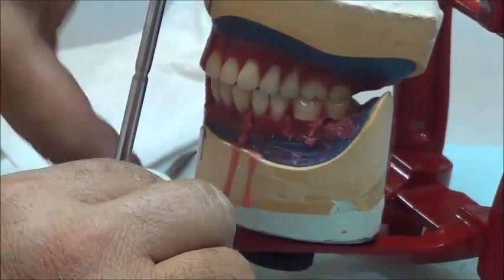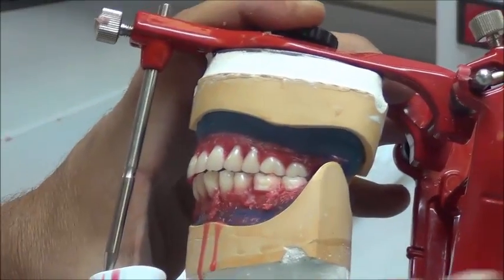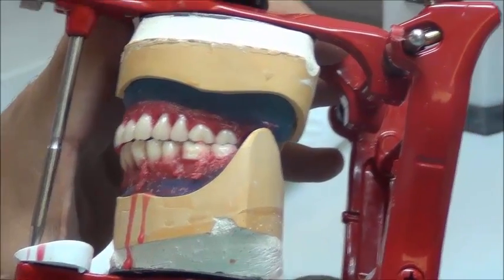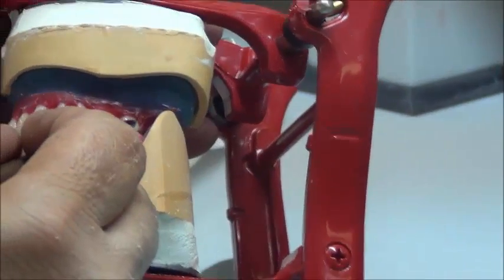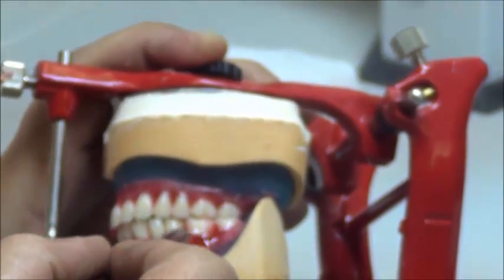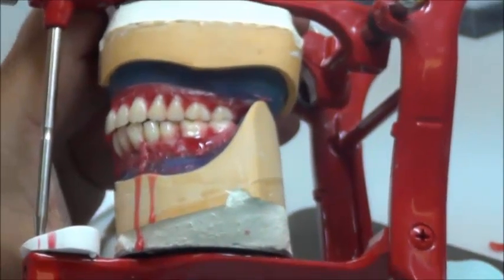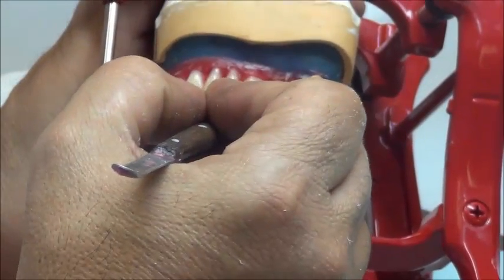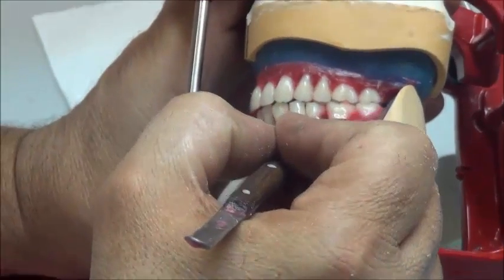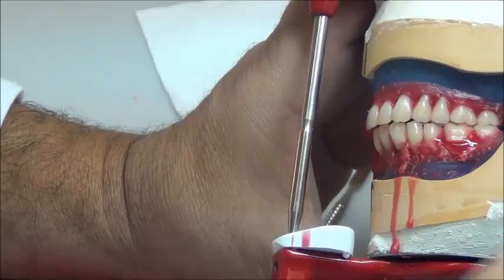In our first design, we put the palatal cusps of the upper on the crest of the ridge, so the central fossa is where the palatal cusps of the upper lie, and they are straight in one line and with the central ridge line. What we're doing now is finalizing. Remember that sometimes while you're adding a tooth or two, the position of the teeth change, so always revise your position of the teeth while you're doing your work.